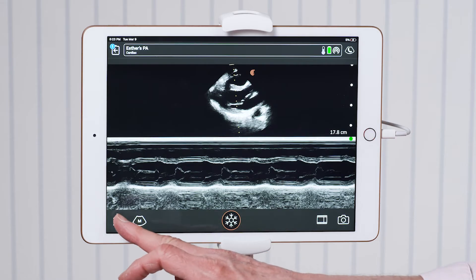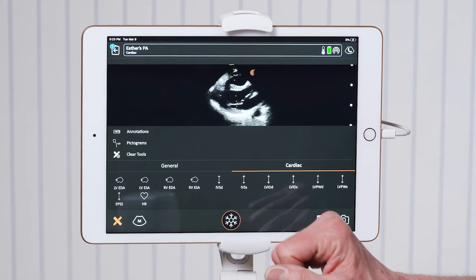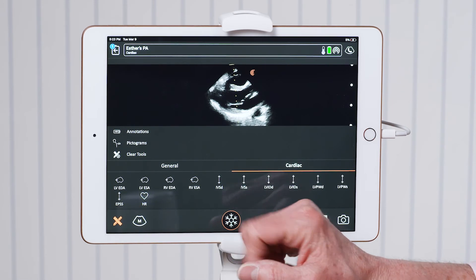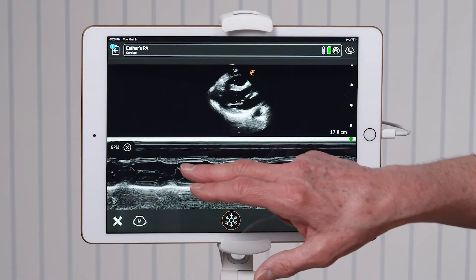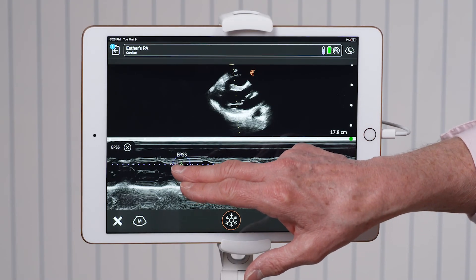I go to the measurement tools in the lower left hand corner and I select EPSS. Then I'll measure from the mitral valve E wave to the septum for the ejection fraction.